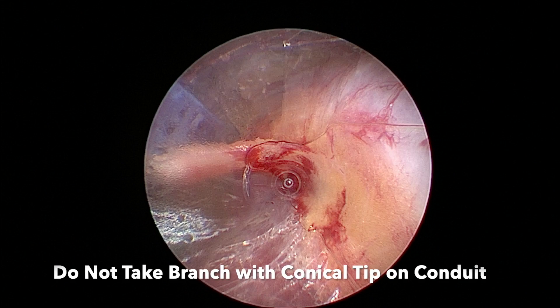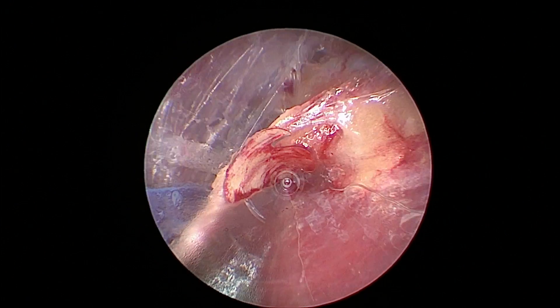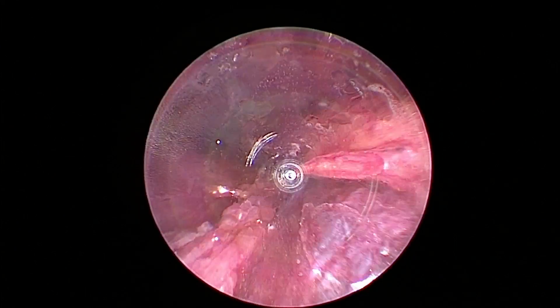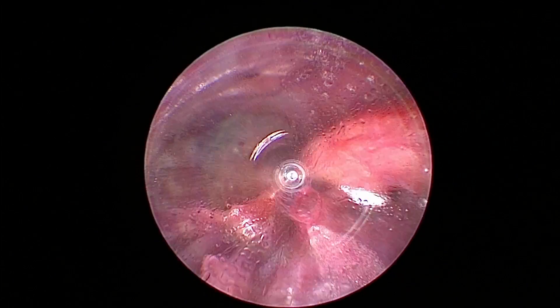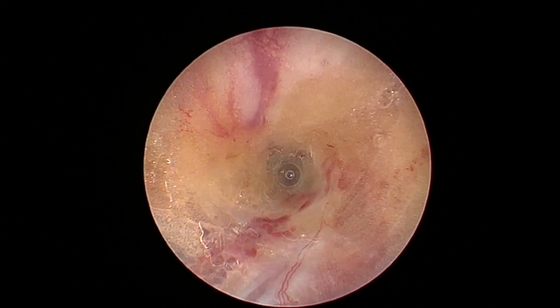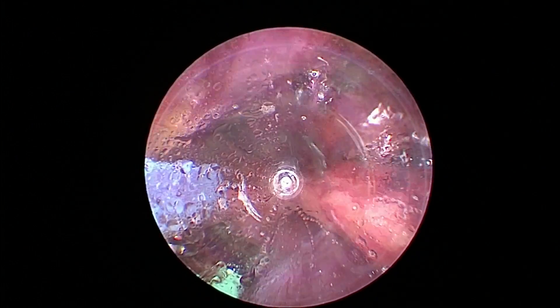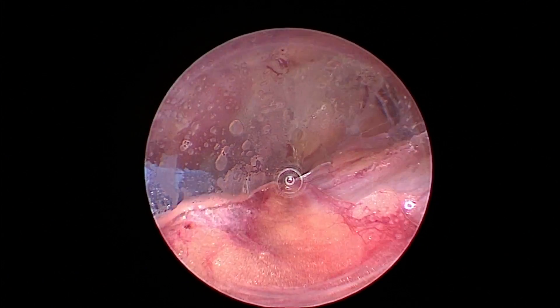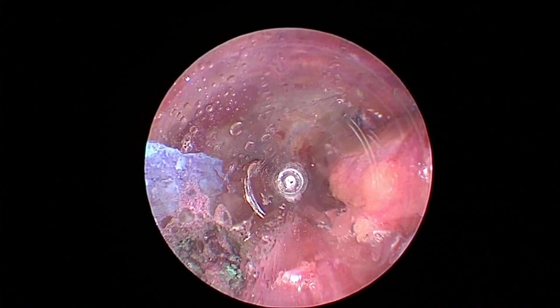Notice my tip was too close to the radial — I moved it lateral, away from the branch and away from the artery, and then took the branch. I continue to work circumferentially — I go left, then right, then posterior — and just slowly open this tunnel up, staying on the paired veins and not the artery. As you go up the arm you're going to actually have more of a pedicle — there's more adventitia, more fat probably attached to this pedicle.